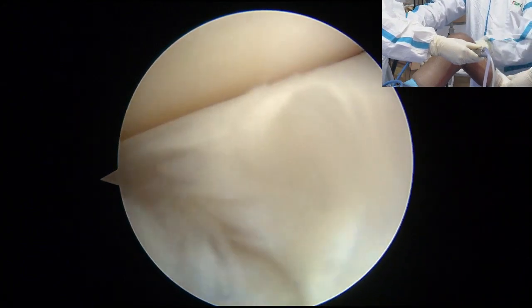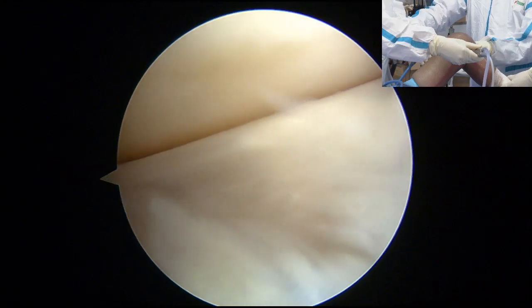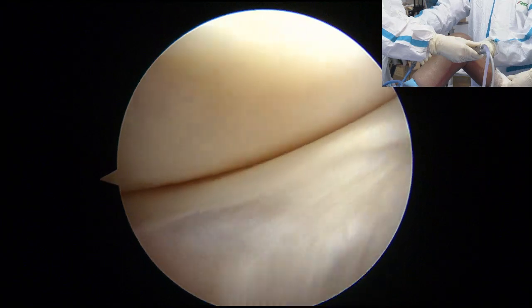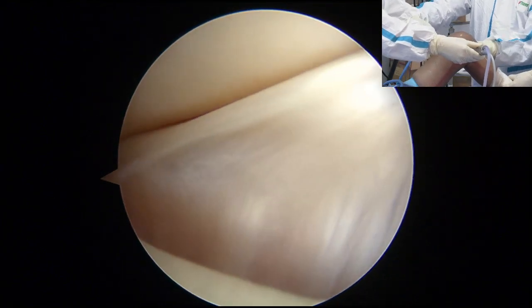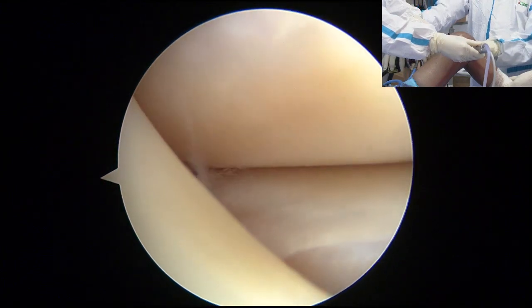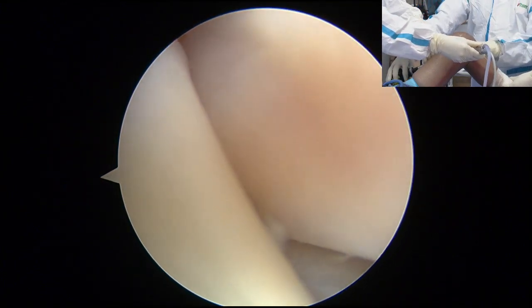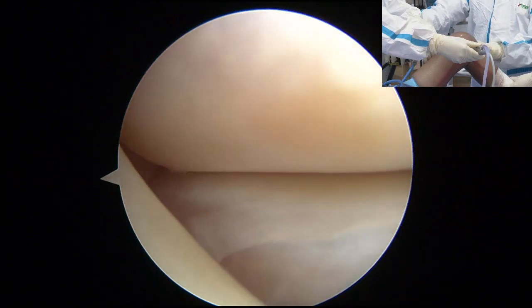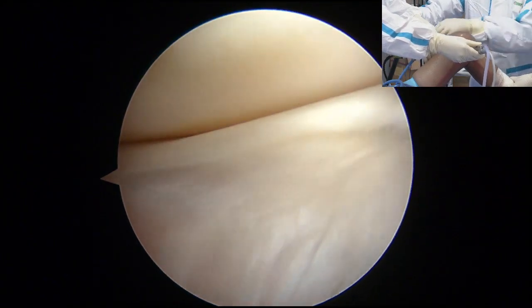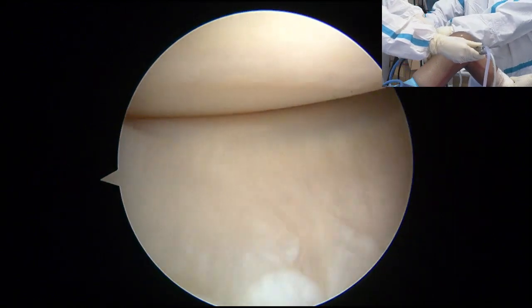Popliteus hiatus. That is popliteus coming here. Okay. Yeah, this is the popliteus hiatus. Okay. And you see that is the meniscus. You see popliteus there. Okay, we call this the fascicle. Popliteus attached there. So from this view, you can see very well. And we use this view for the popliteus reconstruction arthroscopically also, right?